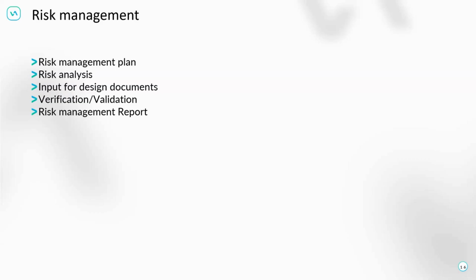So with that point, as you can see, the risk management will be part of your design input and will be part of your product documentation on the risk level, and gives you the next possible information. That will be transferred from the product requirement into product requirements, which will be transferred into the product architecture, into verification, and that verification will then be referenced here in the risk management.